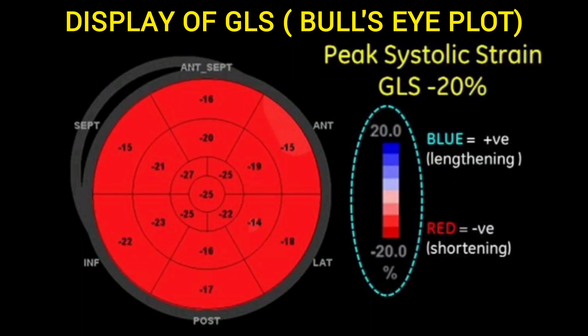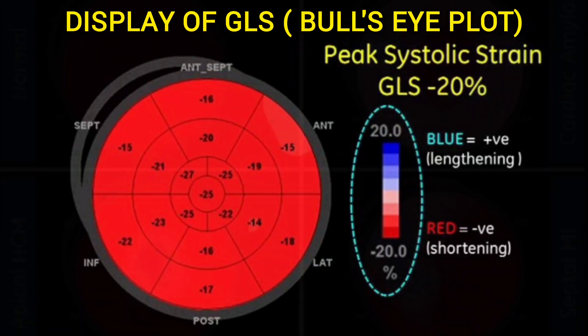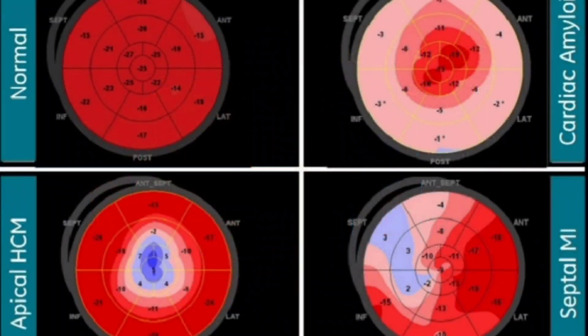As you can see in the color scale, red color illustrates normal systolic shortening, whereas lighter shades of red and blue denote reduction in systolic shortening. Here are some examples where you can see reduction in systolic shortening in some of the regions of the LV.